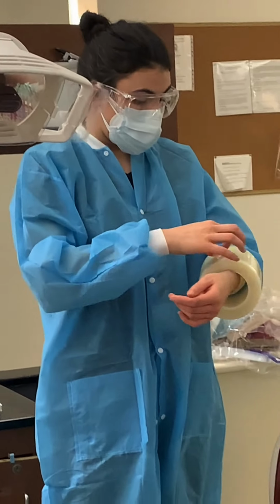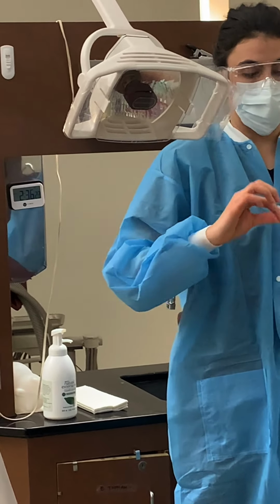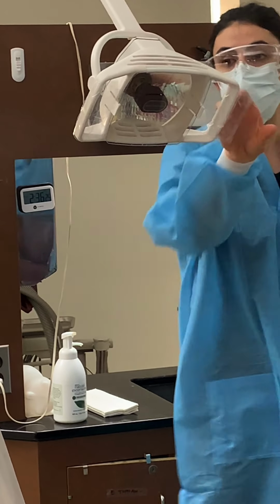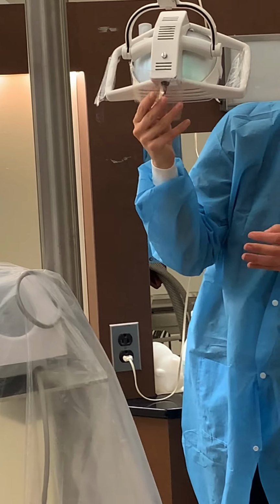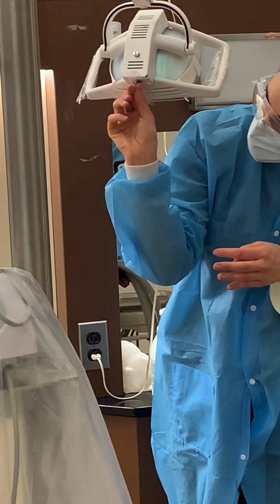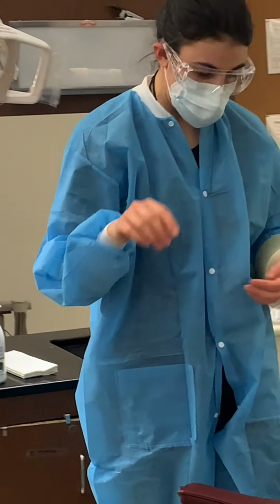We're also going to barrier the on-off switch. Same thing here. And then I'm just going to kind of put it on the switch like you would grab it, like that. Okay, so this is how you would barrier the lamp.